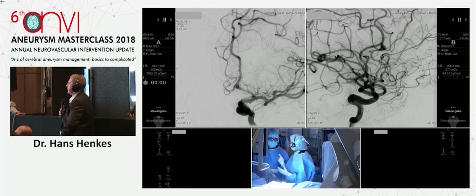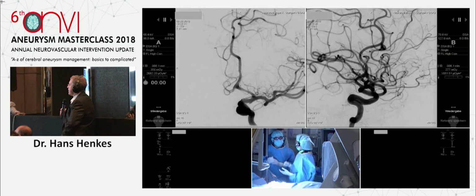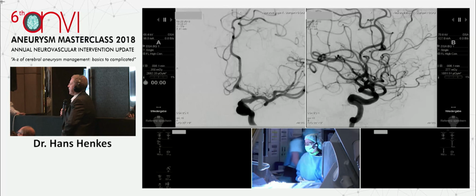I think we did it on the same machine, right? Yeah, you are right. We have it in this machine. So the previous treatment was done on the same system, and Dr. Almata will show us the image in a second.